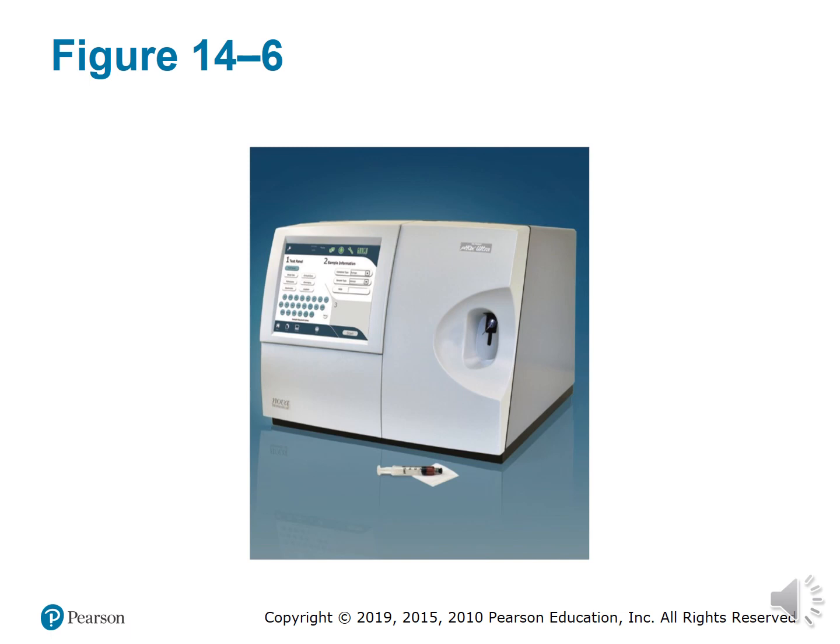It does patient-focused testing. It not only tests the patient's blood gas, but it also tests the pH level in their blood, which is very critical, especially if someone has a heart or lung disease. So it checks the PO2 and the PCO2 as well as the pH in a person's blood.